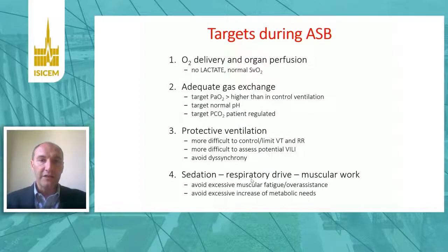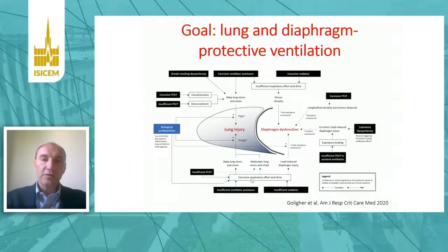And also, we need to adjust properly sedation in order to avoid excessive muscular fatigue and to avoid over-assistance and to avoid an excessive increase of metabolic needs. So it's more difficult to set assisted spontaneous breathing modes of ventilation compared to controlled modes of ventilation. And the goal of a proper setting is to protect both the lung and the diaphragm.